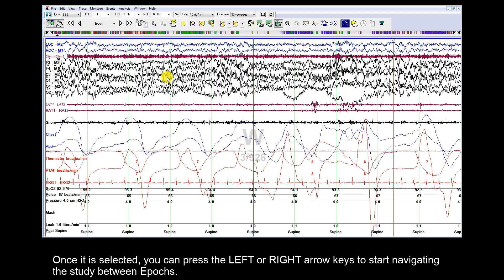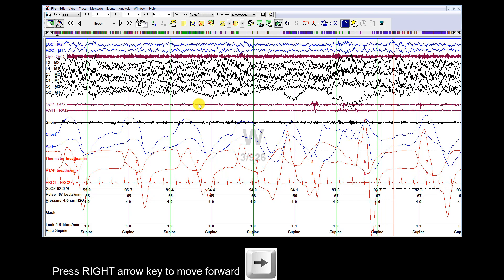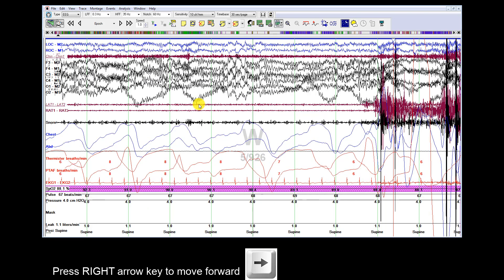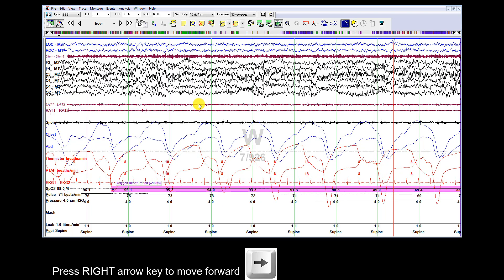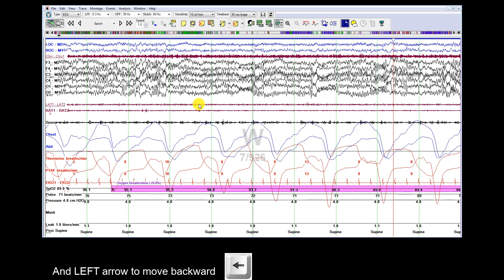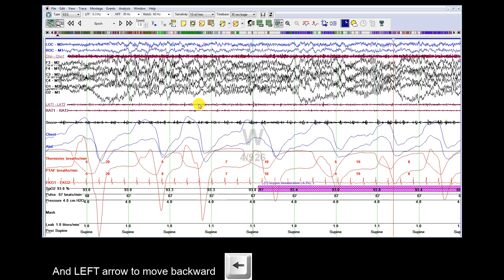Once it is selected, you can press the left or right arrow keys to start navigating the study between Epochs. Press the right arrow key to move forward and the left arrow key to move backward.